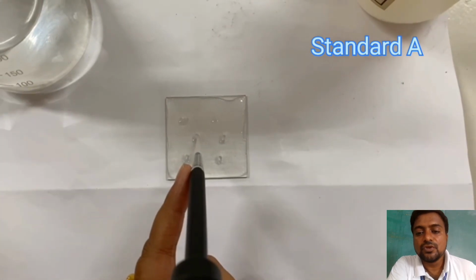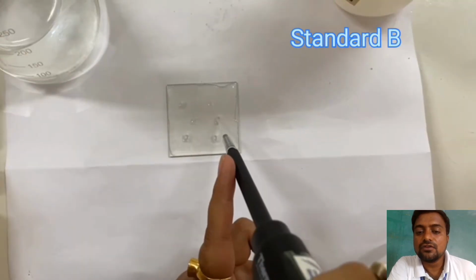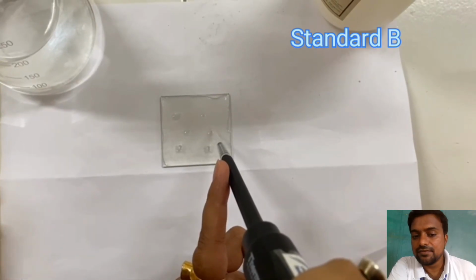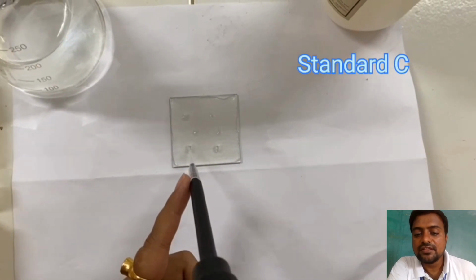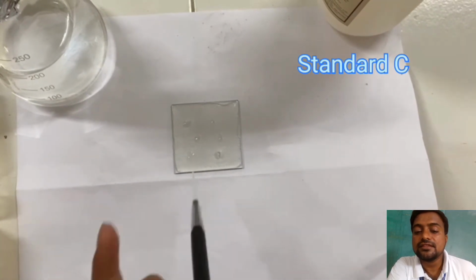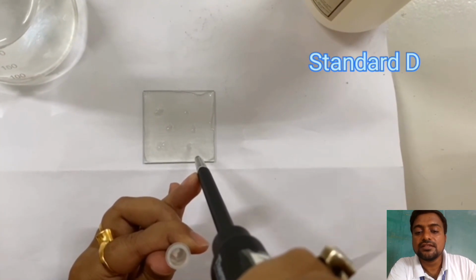So we had two tests, test A and test B, and we are also going to add four standards: standard A, standard B, standard C and standard D. As is the routine procedure, these standards will help us in determining the test concentrations T1 and T2.